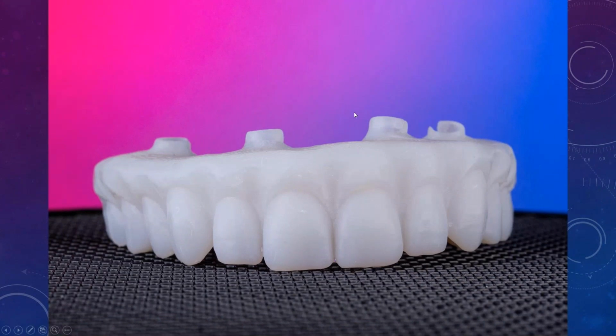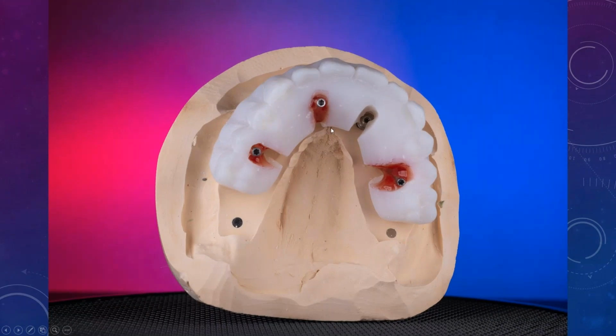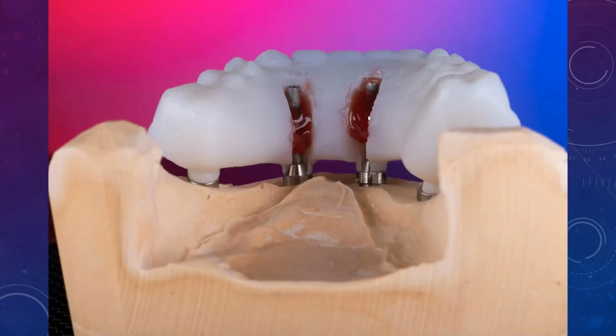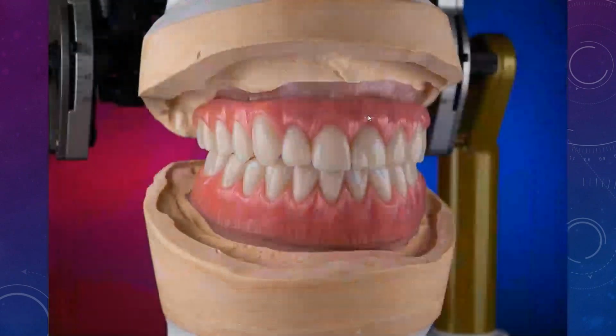You've got some areas here that didn't come through, but it has. What I will do is cut the holes in the areas where the attachments are, and then take some longer pins and connect things directly to the abutment and hold it in place with some jig gel. Now, if the pin is too long, you can cut it in half, cut a slot into that pin, and use a small slotted screwdriver to hold it in place. I've done that before, guys. Basically everything holds in place, and you can mount those stone casts and do a full setup.